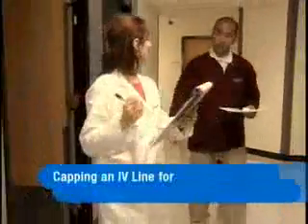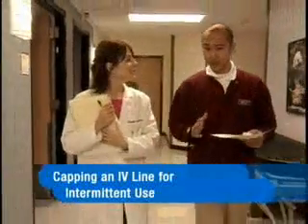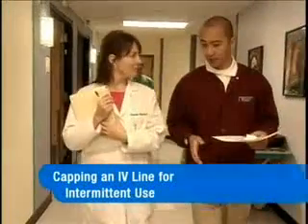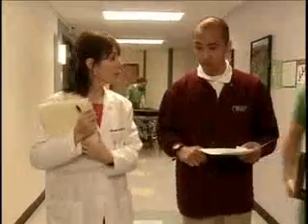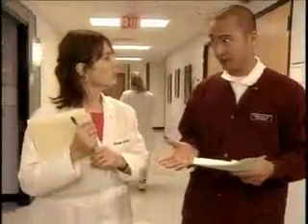Hey, Robert. My patient is eating and drinking enough on her own to meet her needs, so her doctor has decided to stop continuous infusion of IV fluids. It looks like you have the supplies you need: alcohol swabs, a syringe with normal saline for flushing, tape, and the MAR. But my patient is receiving IV antibiotics to treat an infection, so we'll need an access to give her the medications. Right, so we'll cap the IV line and leave the site as an access point for intermittent or emergency use. So we'll leave the IV catheter connected to the short extension tubing and sealed with an access cap? That's right. Let's go.